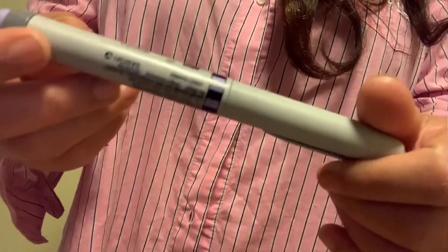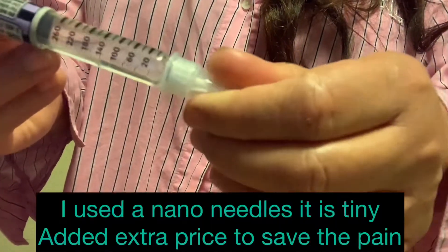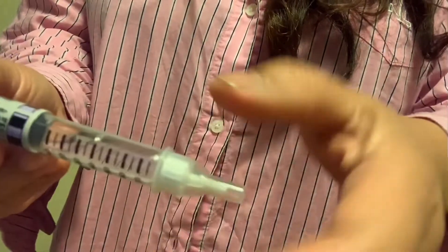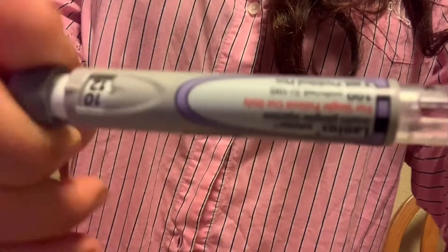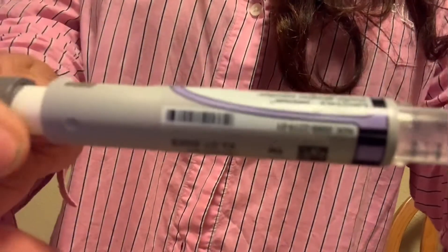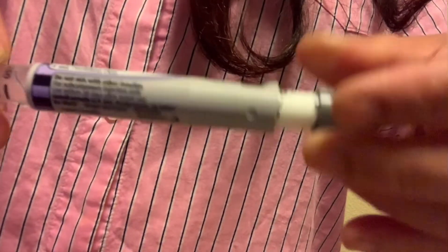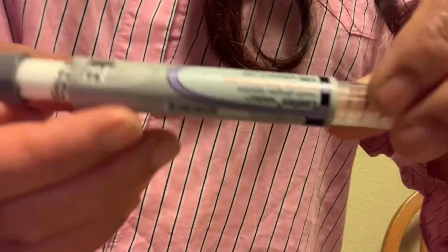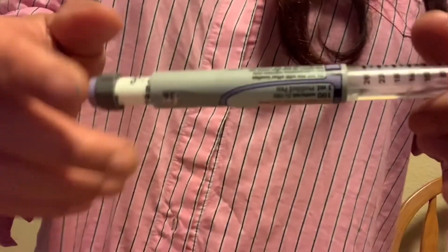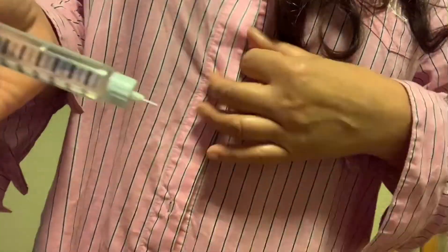This is my insulin — I just connect the needle, it's very easy. I'm using 34 units every night. That's 34 units, my dose every night. Plus I take 1000 milligrams of metformin twice a day, so that's what I do — those are my needles.